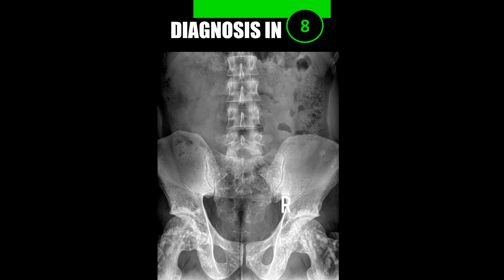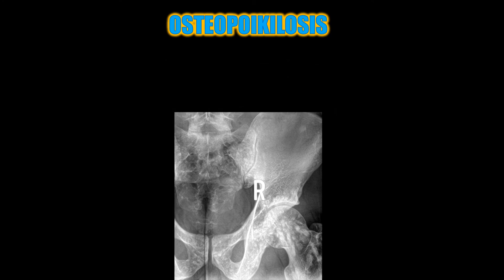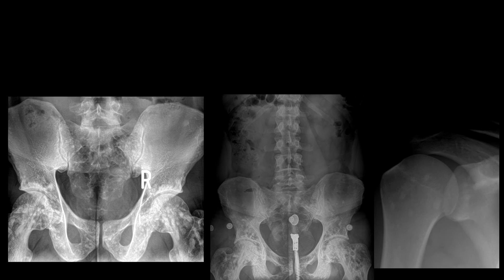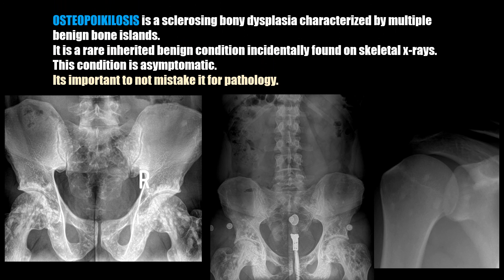Case number nine: osteopoikilosis is a sclerosing bony dysplasia characterized by multiple benign bone islands. It is a rare inherited benign condition incidentally found on skeletal X-rays. This condition is asymptomatic and it's important not to mistake it for pathology.